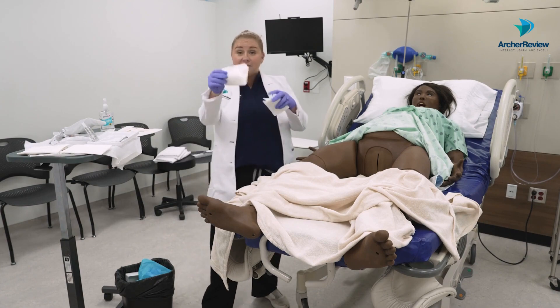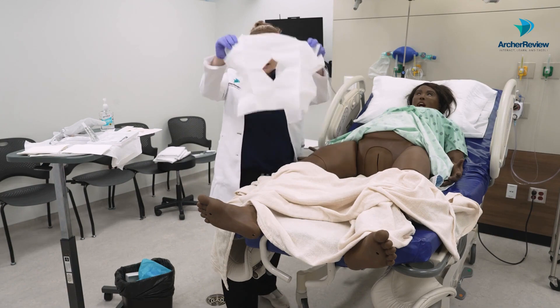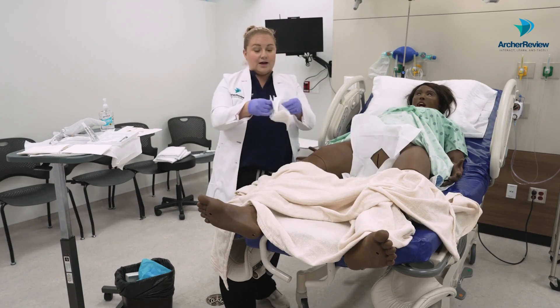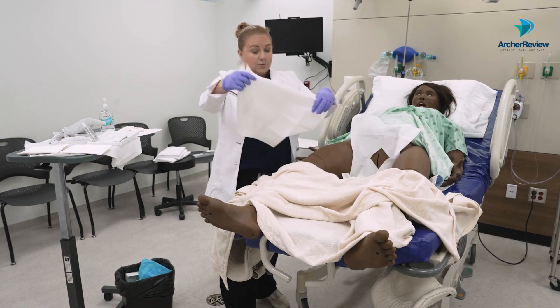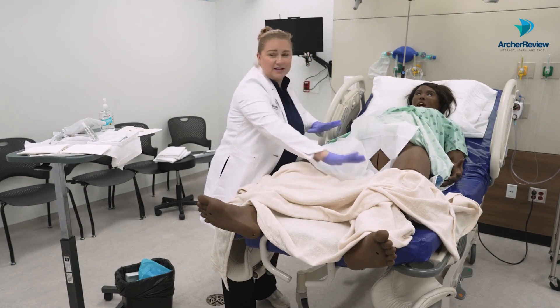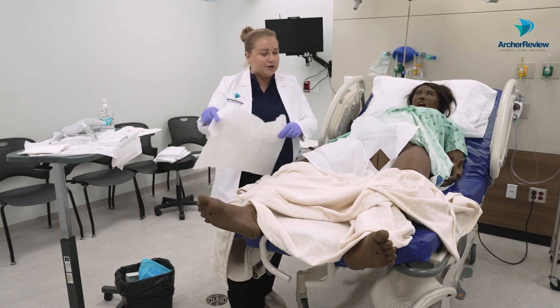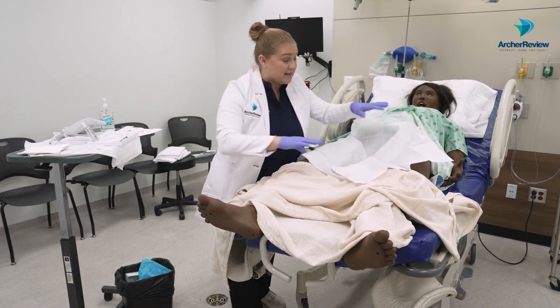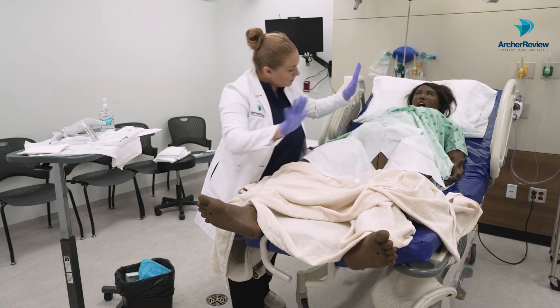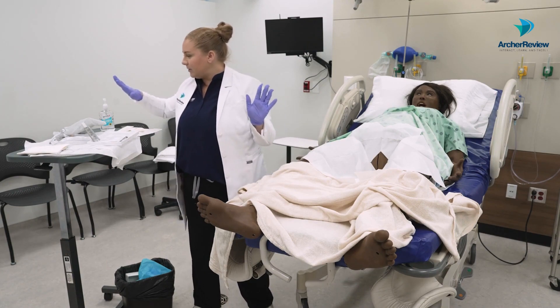Let's grab these sterile drapes — they should come in your Foley insertion tray. You see how they have a little hole here so we can put that where we need it. I'll grab a couple: one that we can put over the leg, and I need to create a little area right here that's important for me to place my materials and get where I need to get while still keeping the client safe. That looks good — clean and safe there.